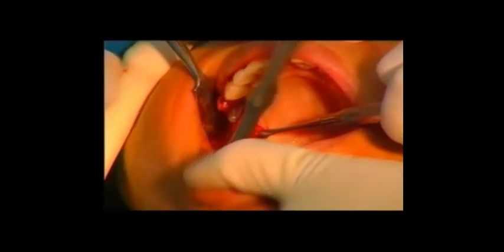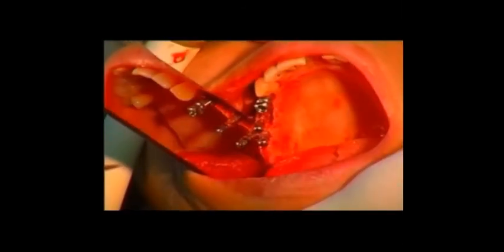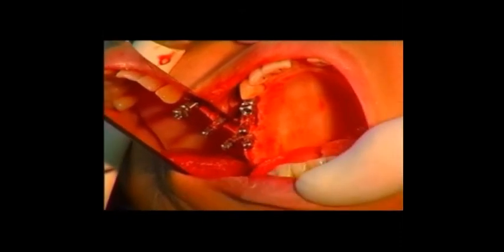Immediately after bone augmentation, implants are screwed into the osteotomies sequentially — in this case 16, 15, and 14. Residual ridge height of four to five millimeters ensures initial fixation for primary stability and optimal integration. A final periapical radiograph is obtained to confirm adequate bone fill and implant location.